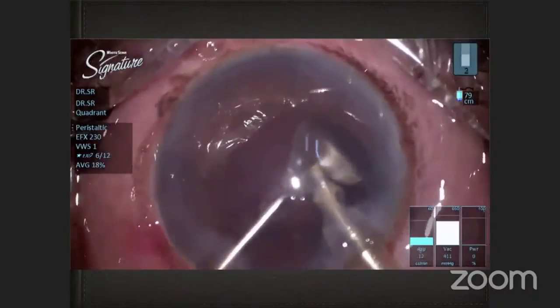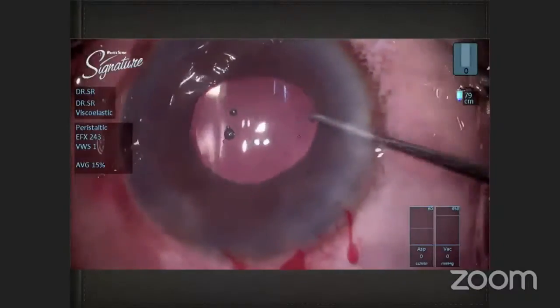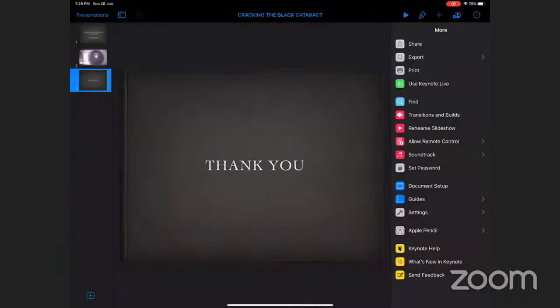Towards the last pieces, one important thing to keep in mind is that the phacoemulsification needle can actually bore through the density of the nucleus, and you have to make sure that your nuclear piece is not above the tip of your phaco needle. You have to ensure your phaco needle is always above the nuclear piece, and there is a sufficient nuclear piece below your phaco needle so that the phaco needle is not directly exposed to the posterior capsule. These are just some of the simple tips that I follow for dealing with these dense nuclear cataracts. I hope you all found it useful.